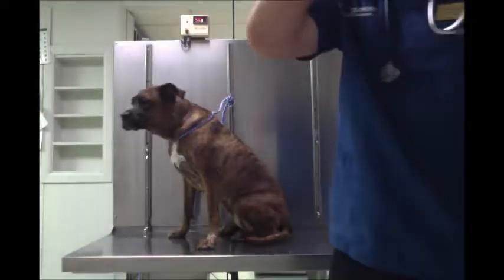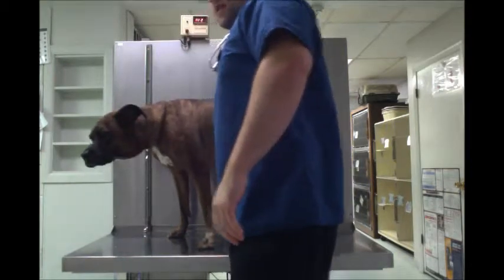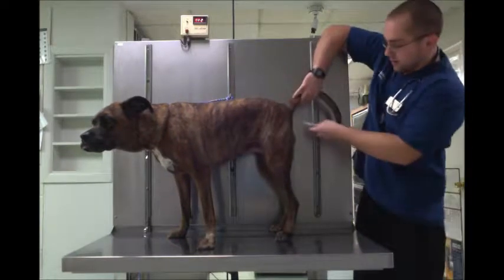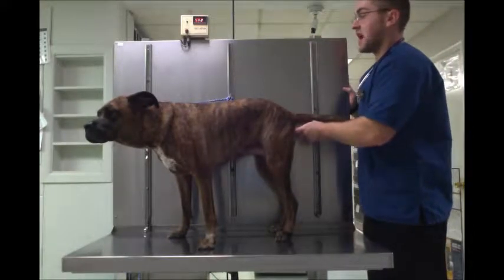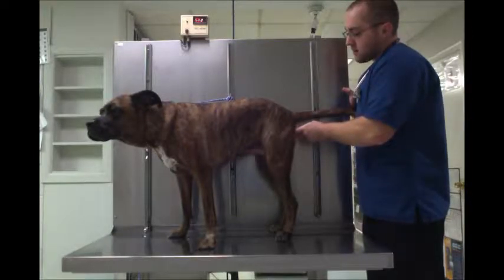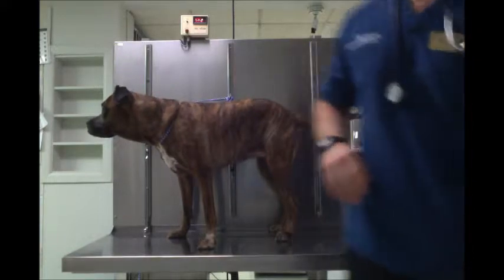Okay, now I'm going to do an examination of our patient. Make sure that she's healthy enough to go under anesthesia. So stand up. First of all, I'm going to get her temperature, and we're looking for anything below 103.5 first, and then nothing below probably 98, 99. So we are right in her butt here. And she is at an even 100, so that is very good.